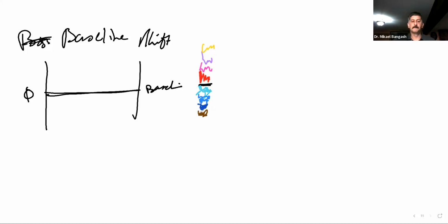Did that make sense? Per standard, unless we switch or invert the spectrum or invert your color map, whatever is above the baseline is a positive Doppler shift, and whatever is below the baseline is a negative Doppler shift.